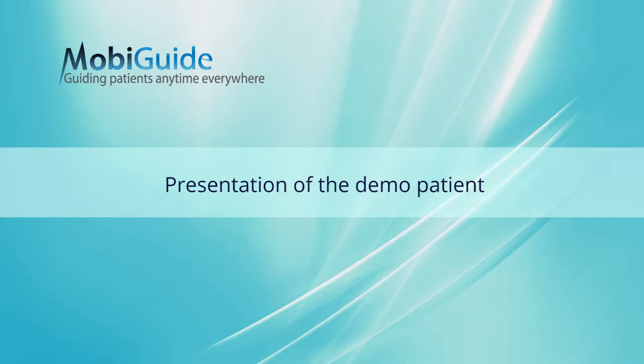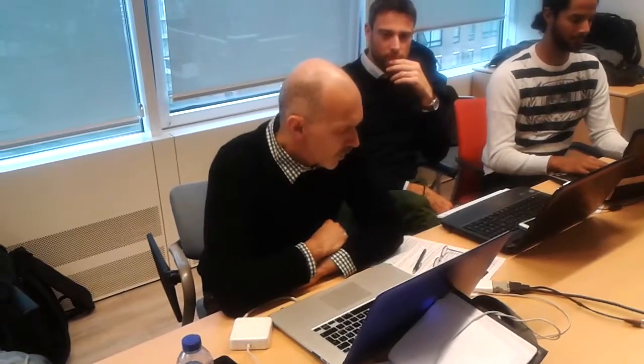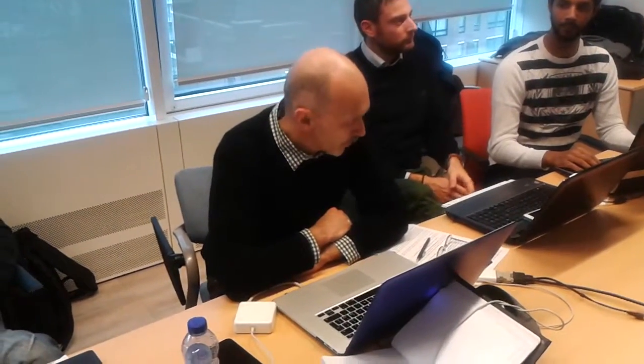This is the atrial fibrillation case demo, and we are presenting a patient. His name is Vincent Blanc. He's a 47-year-old male who had a recent history of very strong palpitation and lightheadedness, and the patient was referred to the cardiologist because the general practitioner did not find anything major.